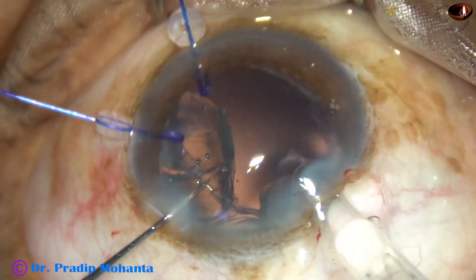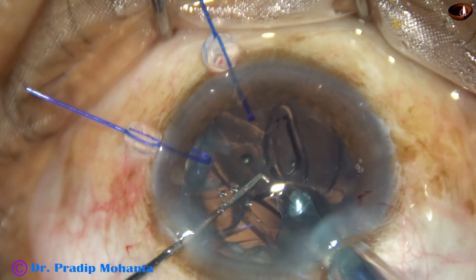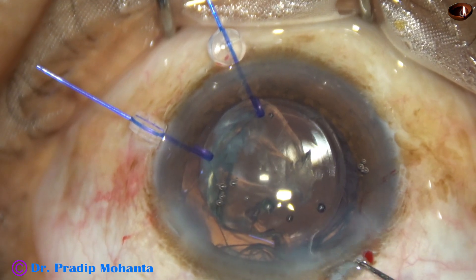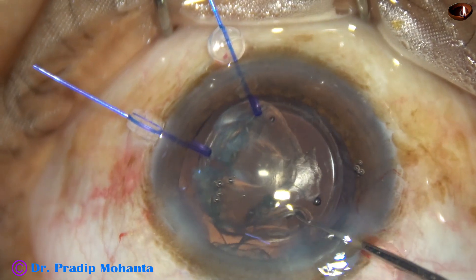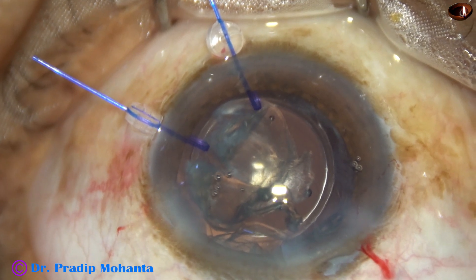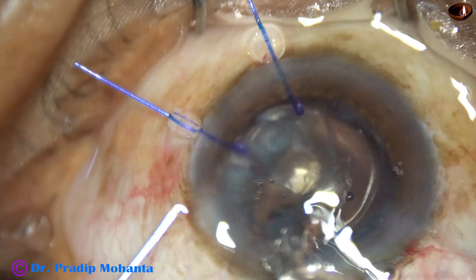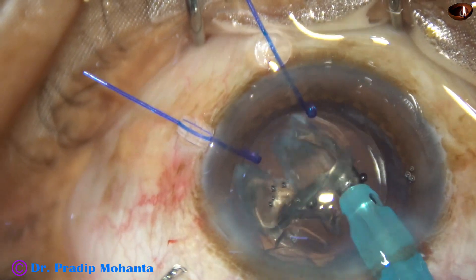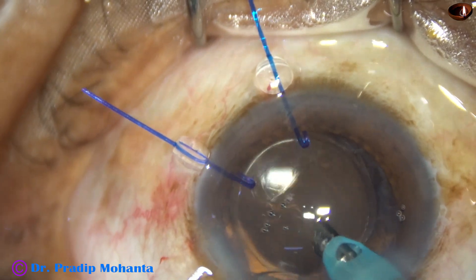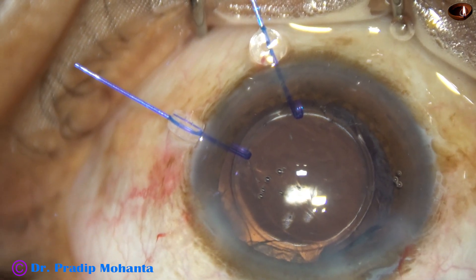I implant a monofocal single-piece intraocular lens in the capsular bag. The lens easily goes into the capsular bag because the rhexis size is only about 4.5 millimeters. I then take the phaco needle again and emulsify this epinuclear shell over the intraocular lens, thus protecting the posterior capsule.